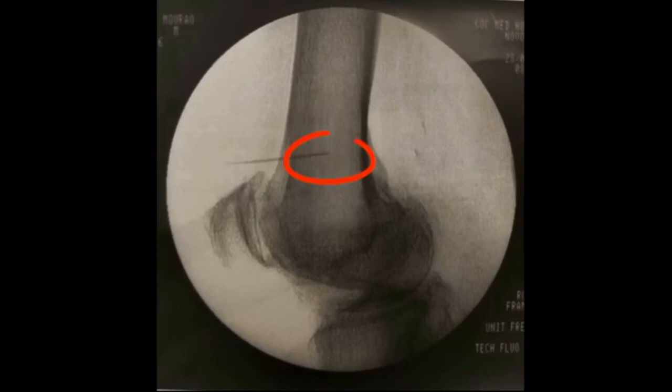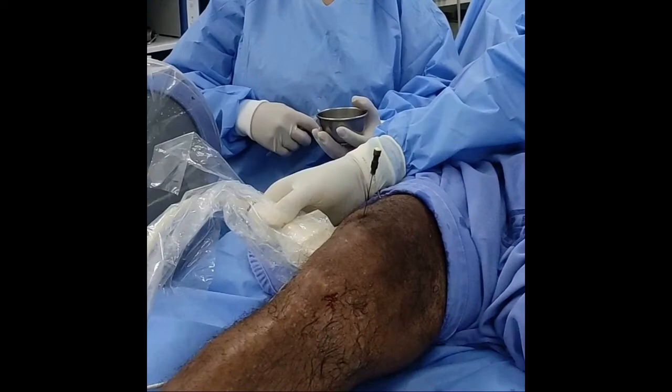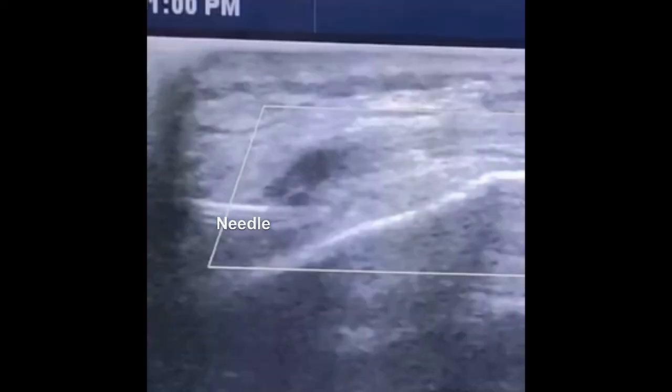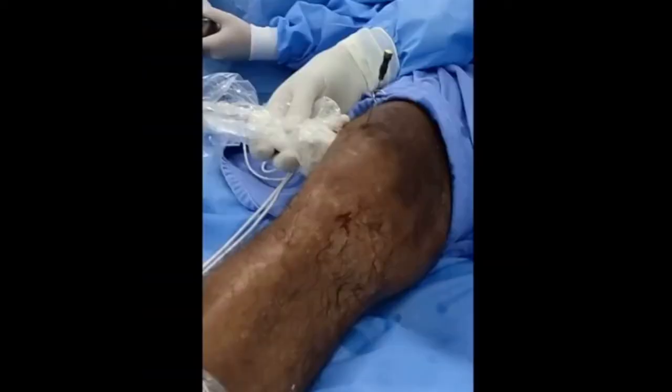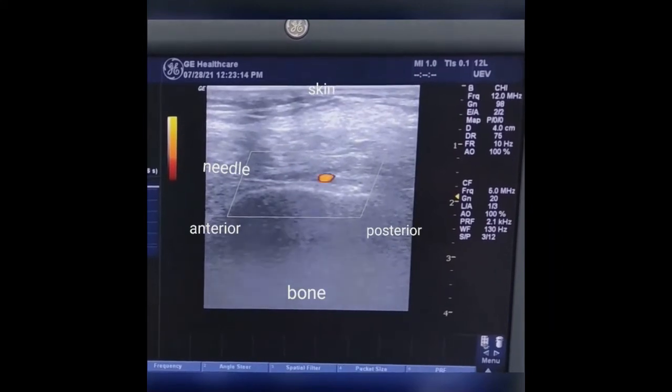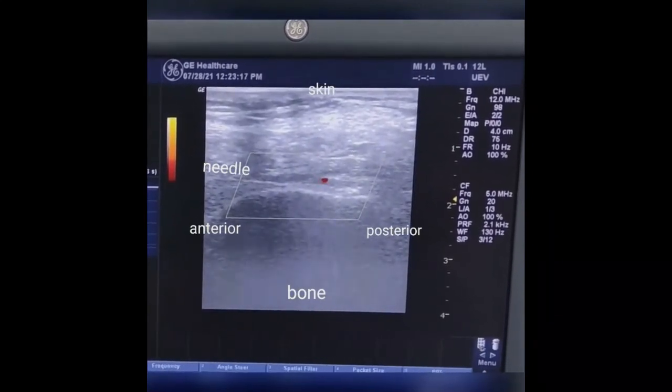At this time, we use ultrasound (USG) for positioning control. The transducer index is pointing proximally on the lateral aspect of the thigh, touching the skin at the point where the needle is positioned. We gently move the transducer until the needle is visualized, then rotate the transducer 90 degrees so that the index points up and follows the needle in its anteroposterior path. With the Doppler function, we locate the supralateral genicular artery and the genicular nerve nearby.